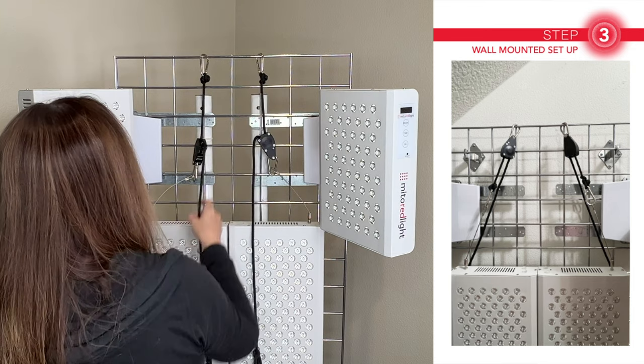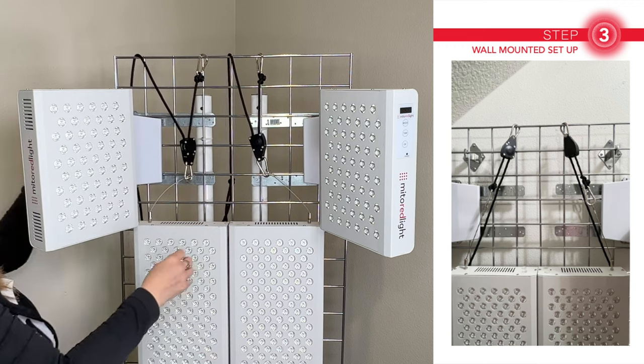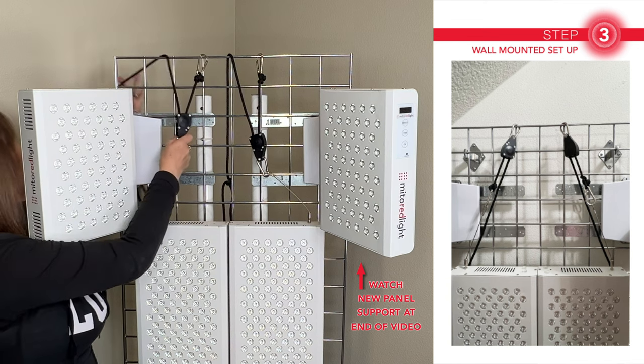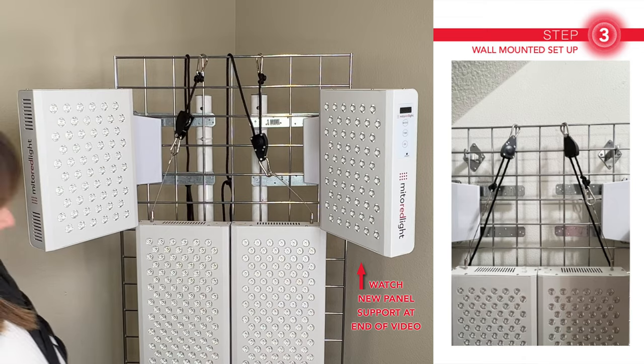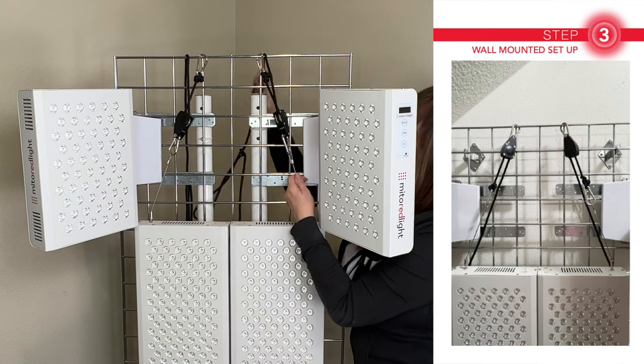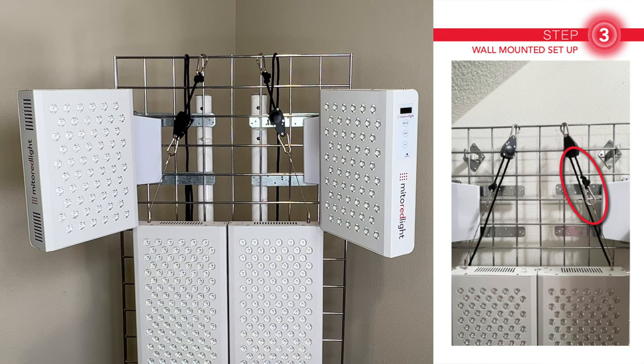Do you see the problem yet? Someone who thought they were being helpful attached the cable to the wrong end of the pulley, so it's actually upside down. I mean, it still works, but look how messy it is. So be sure you attach your cable to the hook that's at the end of the rope, and not the hook that's attached to the pulley itself.